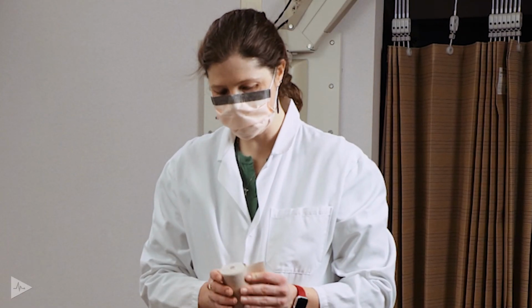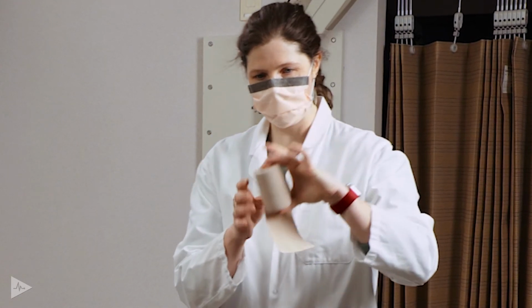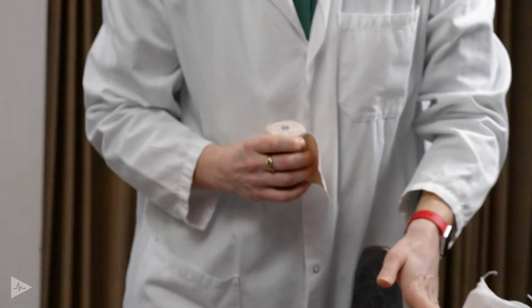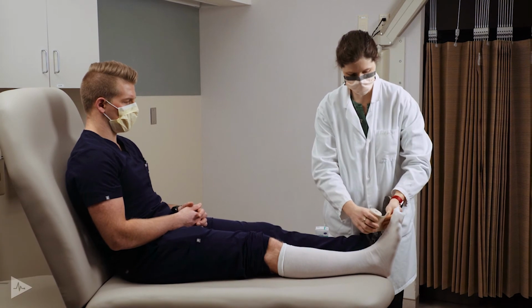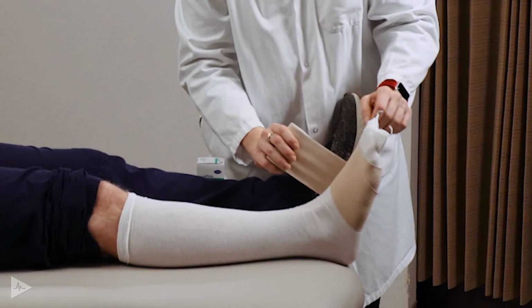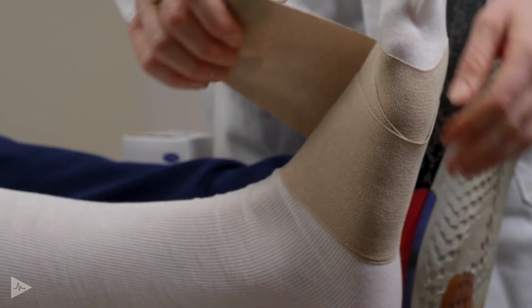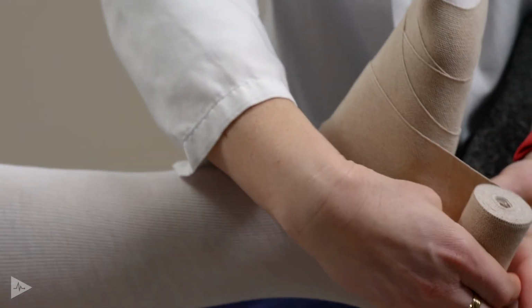If we're applying low stretch compression wraps, then we usually start with a narrower wrap. So this is an 8-centimeter wrap to initially start around the ankle and foot. So when starting the wrap, we want to move from the base of the toes proximally. And so we'll want to take that first leading edge and come across the top of the foot, and then you'll want to begin your overlap. Generally around the foot, we'll look to use what's called a figure of 8 pattern. So coming high, crossing low, coming low, crossing high, and continuing up the foot, crisscrossing back and forth.